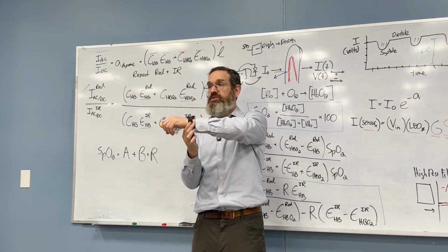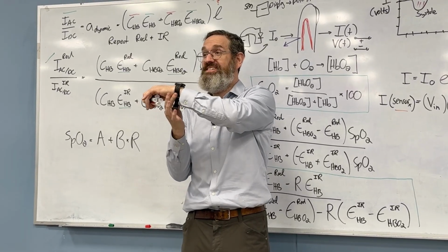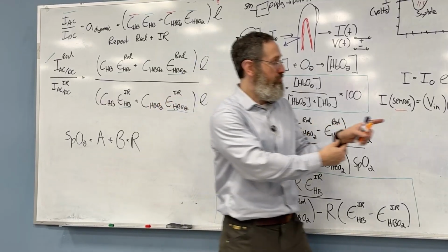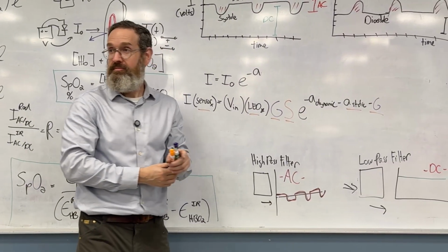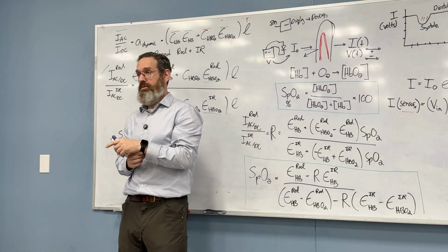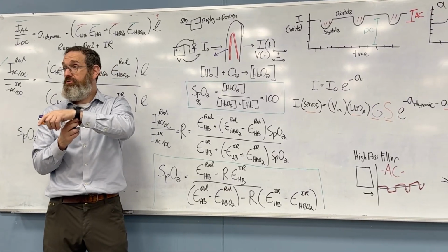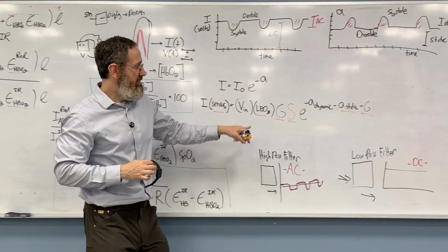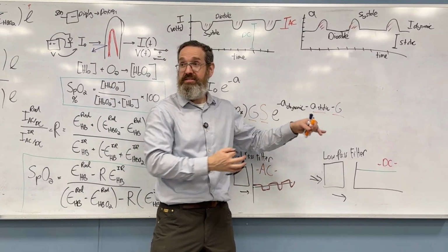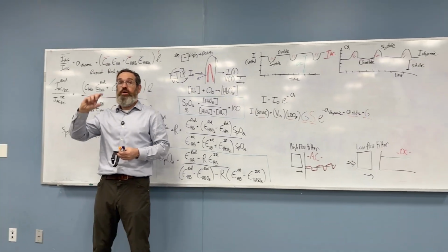But I do know that once I put this watch on, I've set a geometric factor. The G is set. For me, right now, it's 3.7. So 3.7 appears here. But 3.7 divided by 3.7 is 1. And when Emily puts this on, her geometric factor is 6.2, which we don't even know. So she has a 6.2 sitting here. But once I do the math, and I do the high pass and the low pass, and I divide it up, it's sort of like imagine if the light was twice as bright.